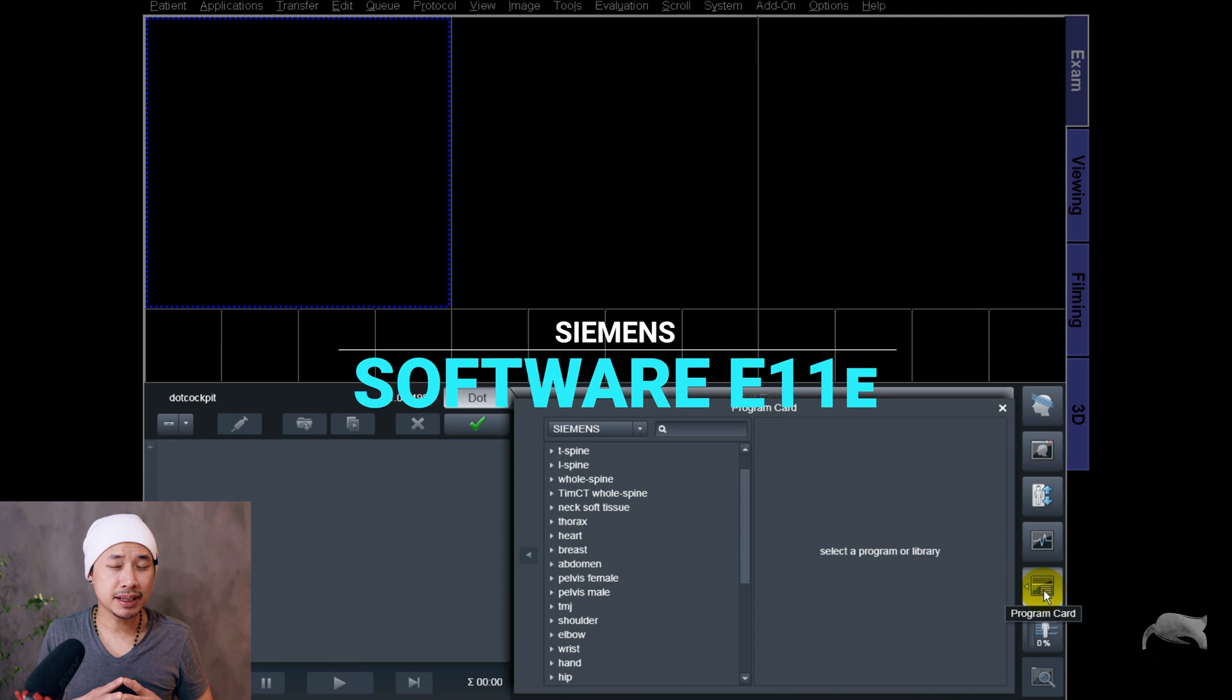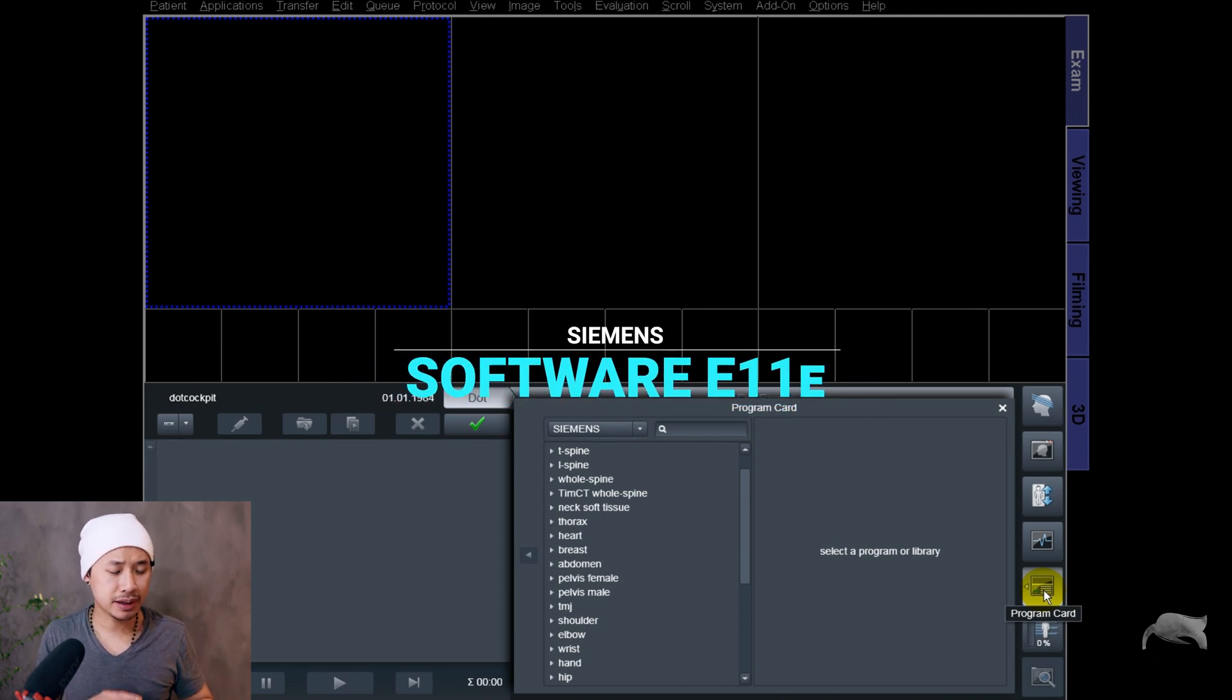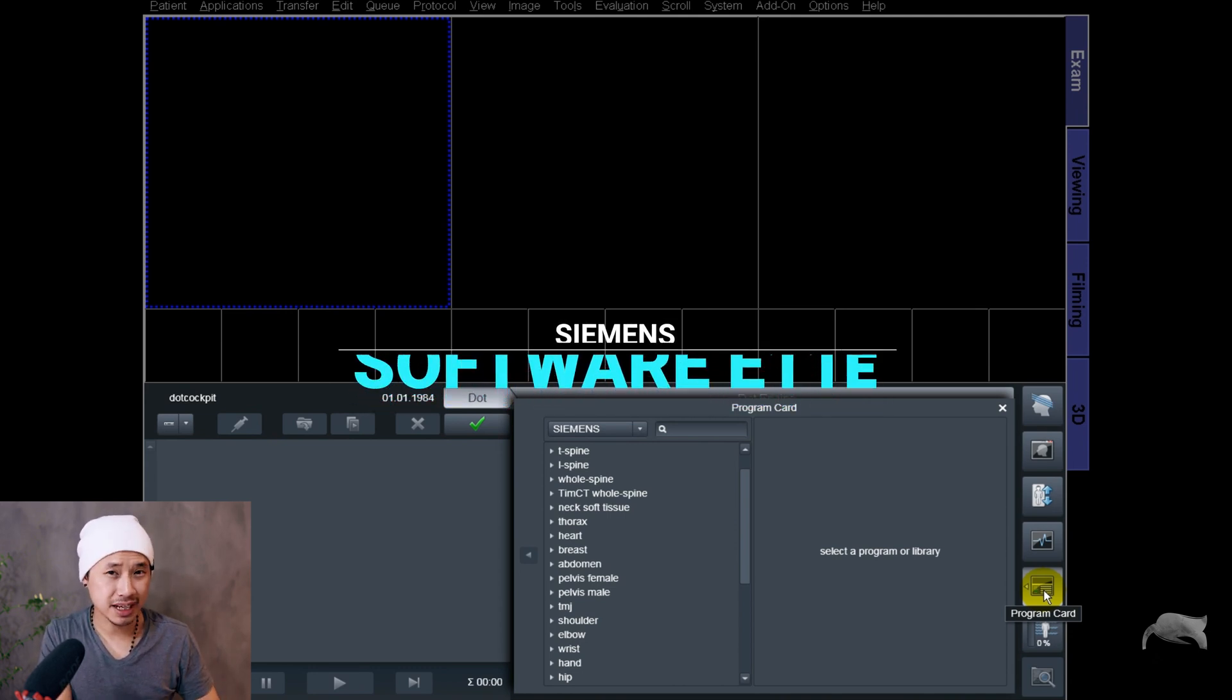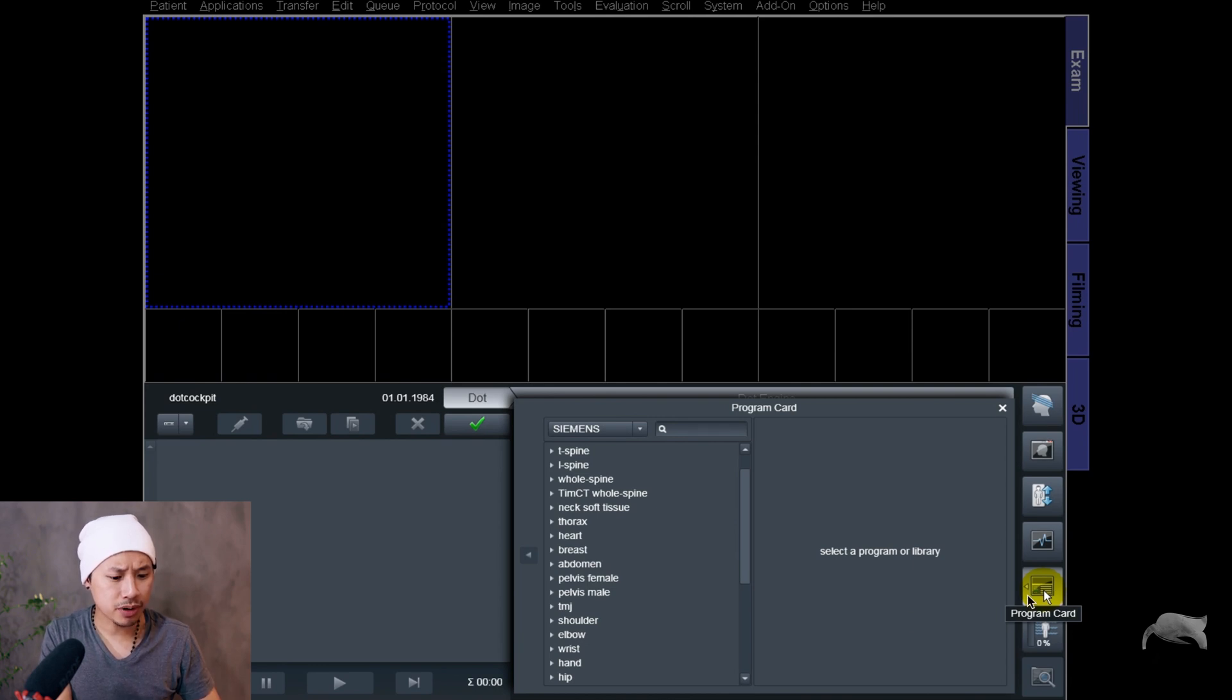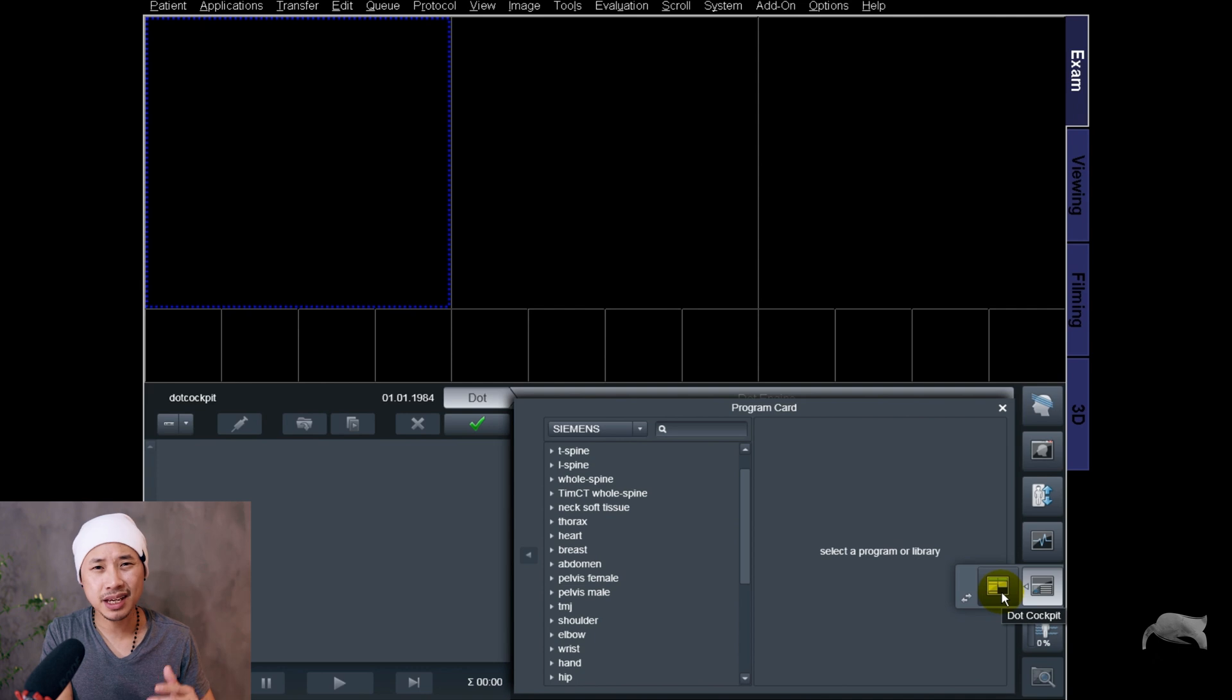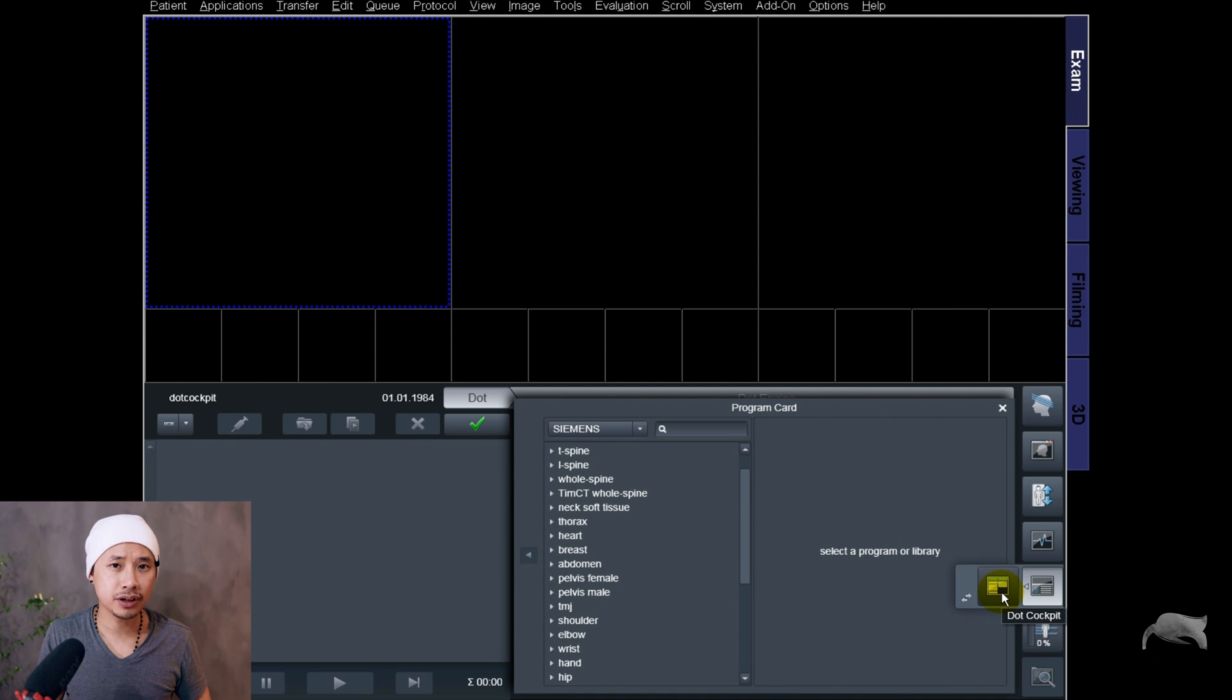Currently we are at e11 software. I have a MacBook right here and I will show you tips and tricks inside the cockpit. What you see in front of you here is the program card and next to the program card you have a button right there. Let's show that one for you - there you go, that's the DART cockpit.